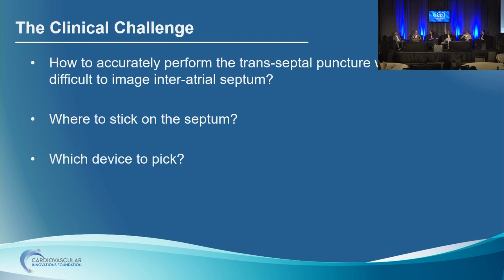I would say that also this is an endorsement for CT planning, because to understand the anatomy and the transeptal location, all that information is given with appropriate imaging up front rather than in the midst of this procedure. Right now you're stuck with a suboptimal transeptal puncture, and you might have to restick again. You hate to do that. You've got such momentum. You're committed to this strategy. It becomes difficult. Whereas if you had the advanced imaging well in advance of this procedure, you would maybe have less difficulty approaching this.